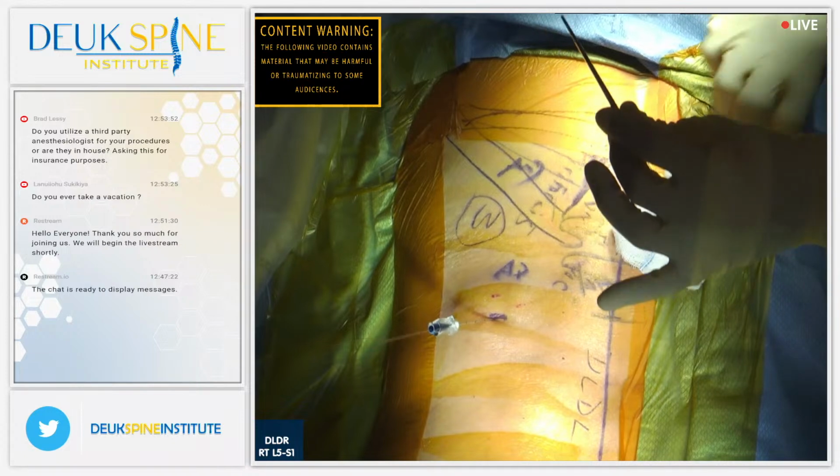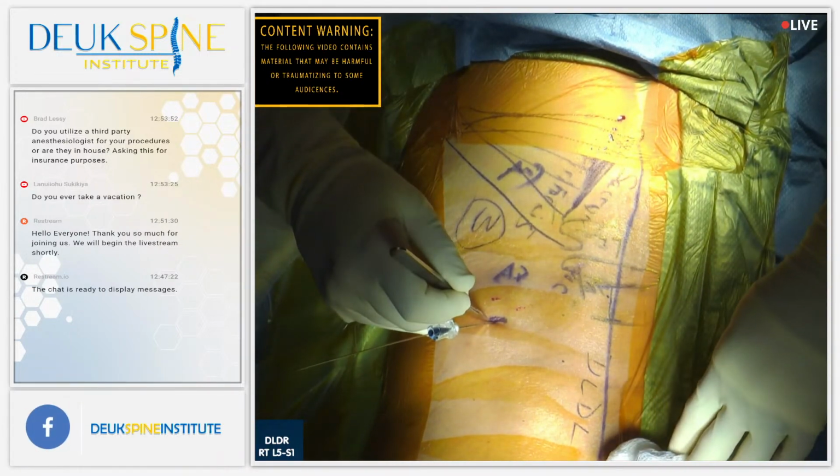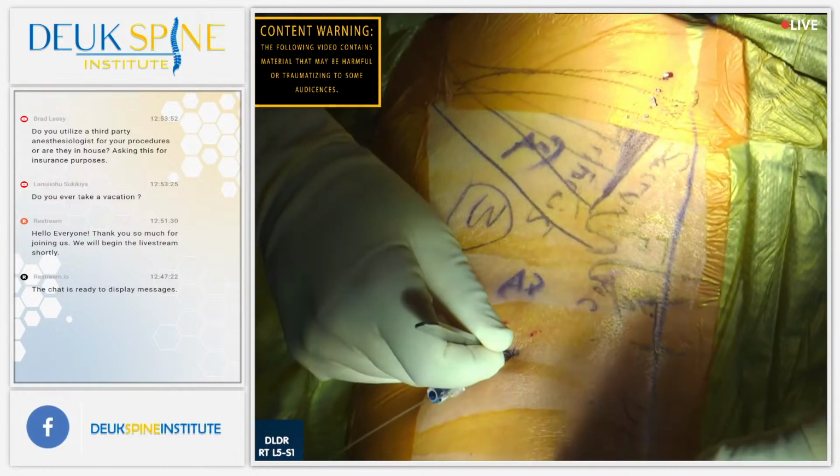Now, is he asleep? Good. So we're going to make our incision. It's going to be a 7 millimeter incision, tiny. The whole surgery will be done through this.